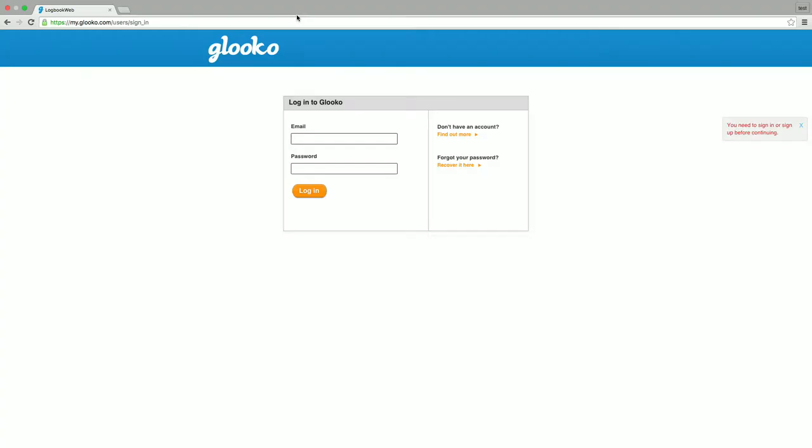First, open your internet web browser and navigate to my.glooko.com. Sign in using your Glooko account.